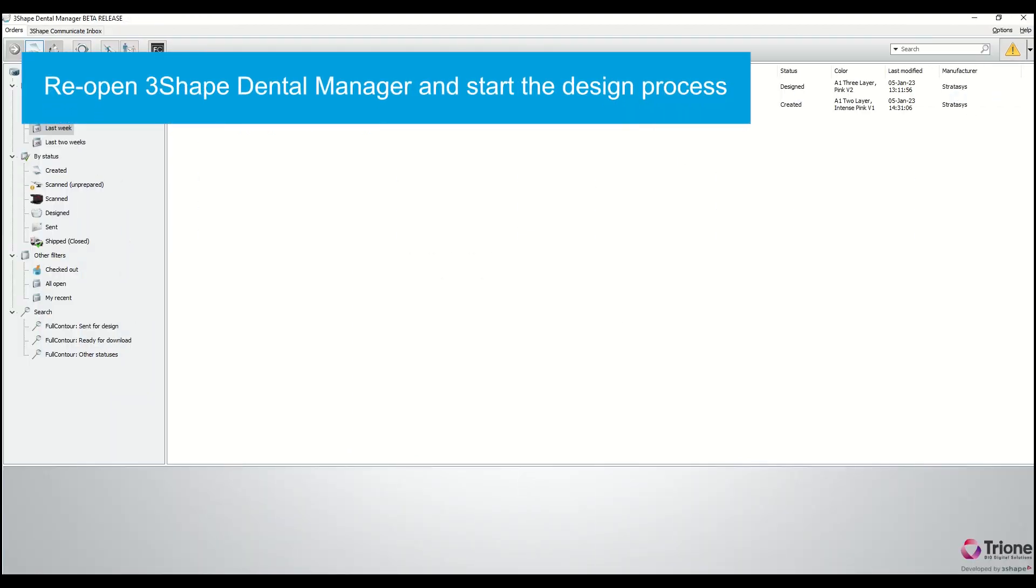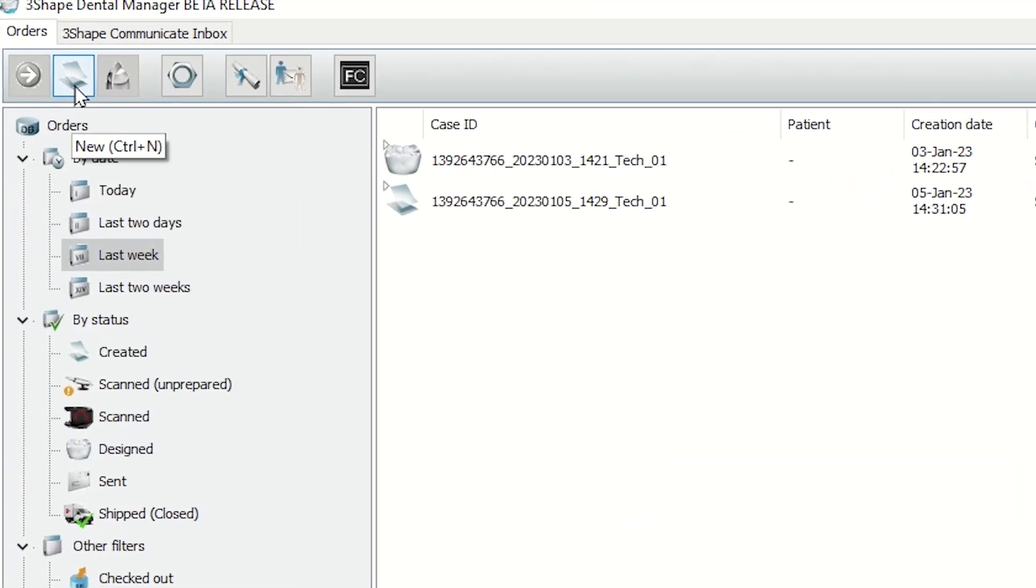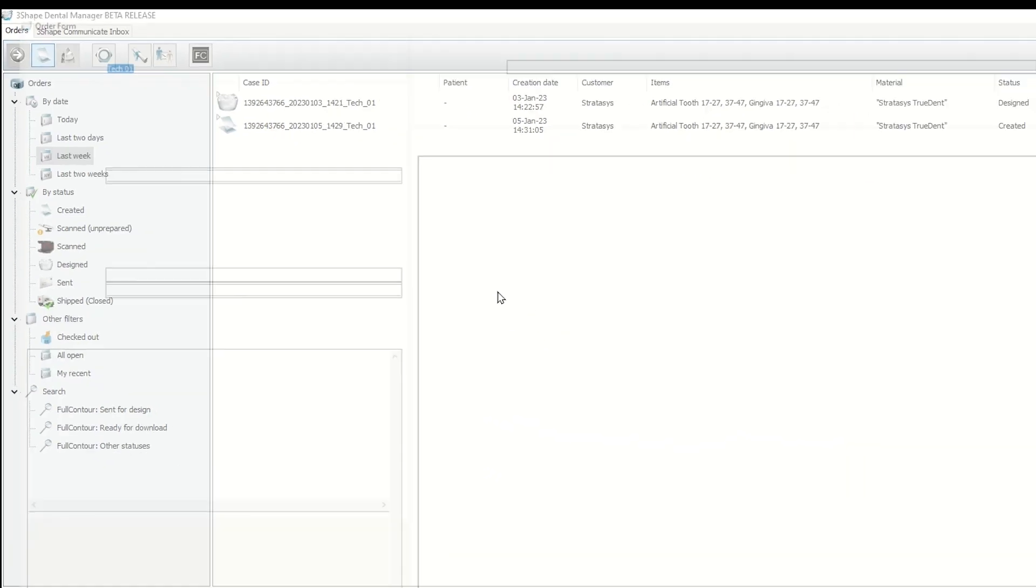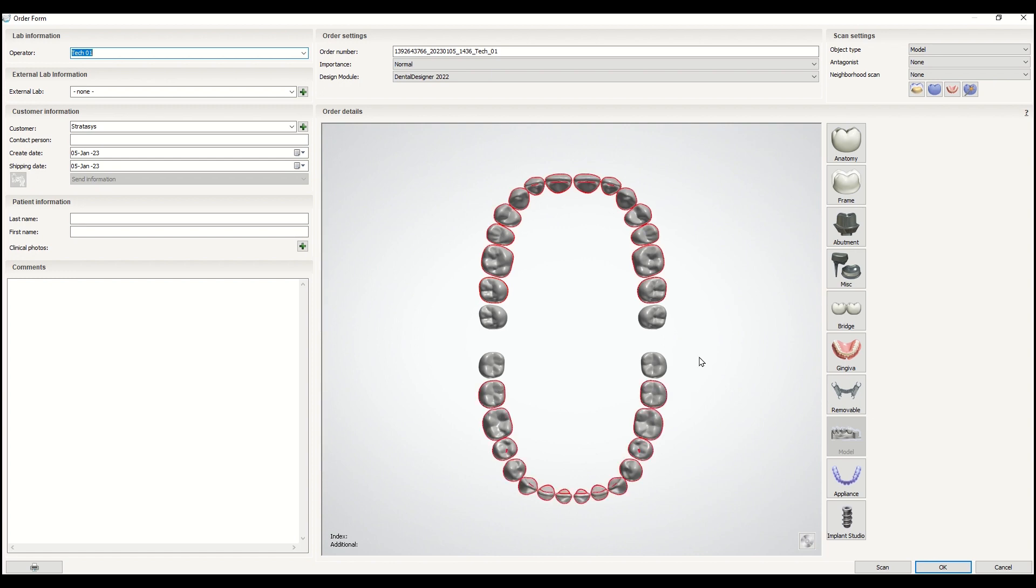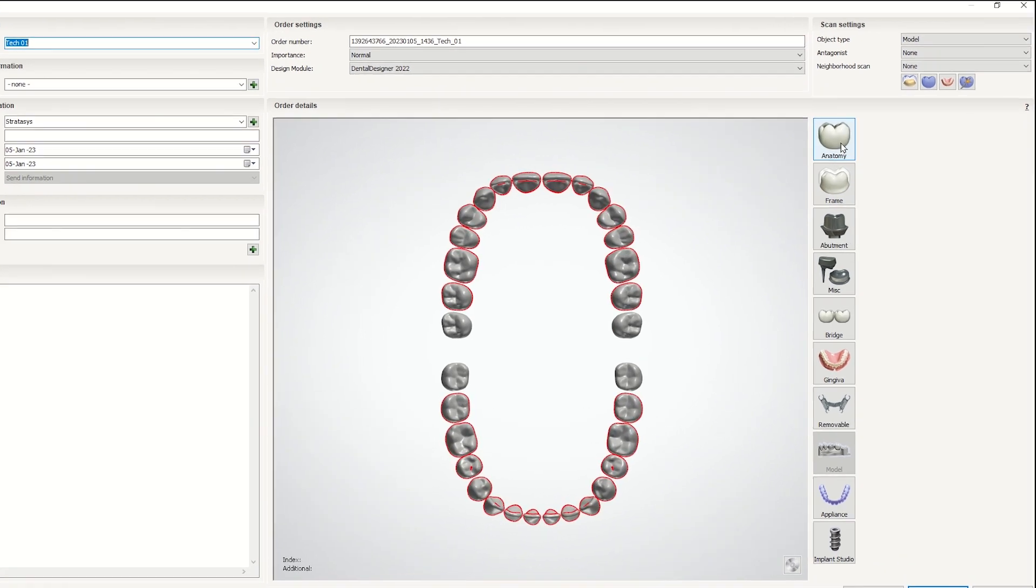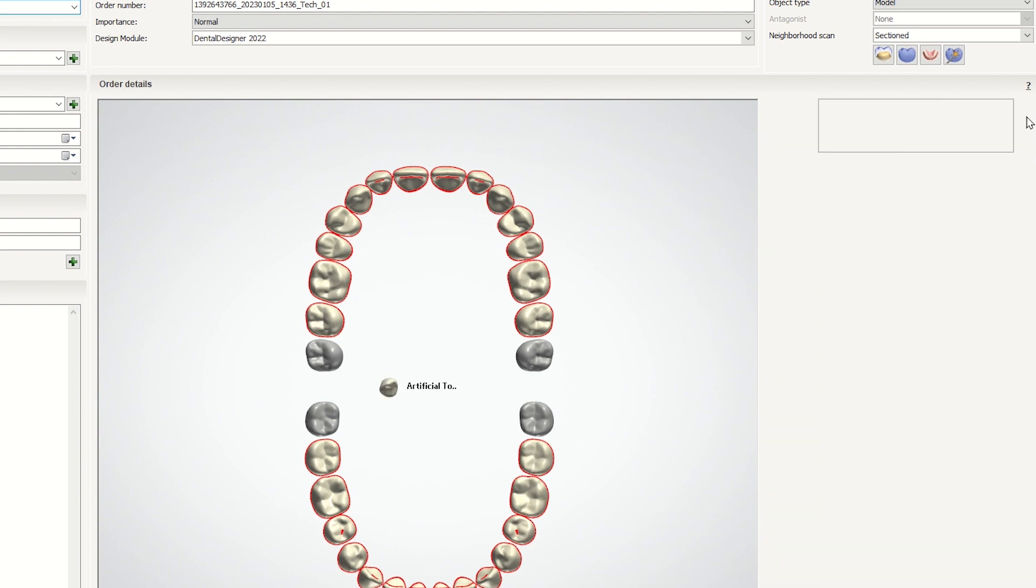Now start the design process. Open a new order form, select the relevant arches, and go to Anatomy. Select Artificial Tooth.